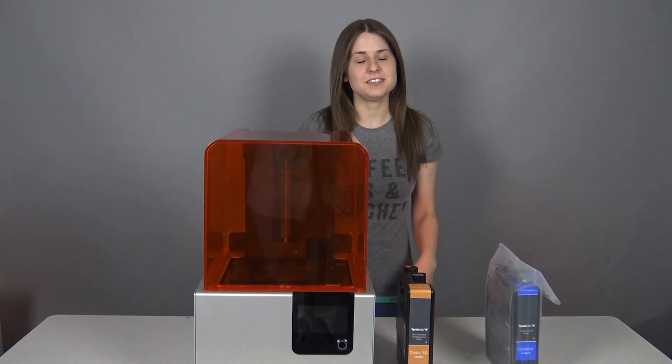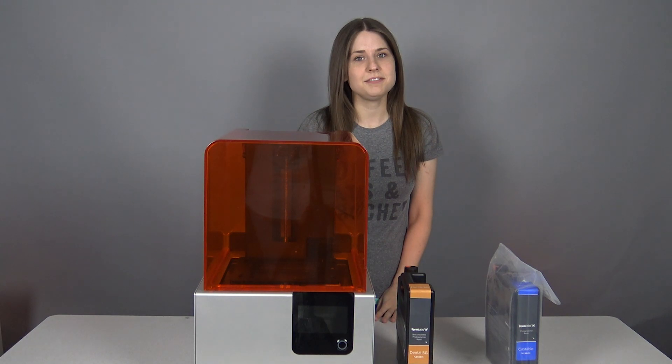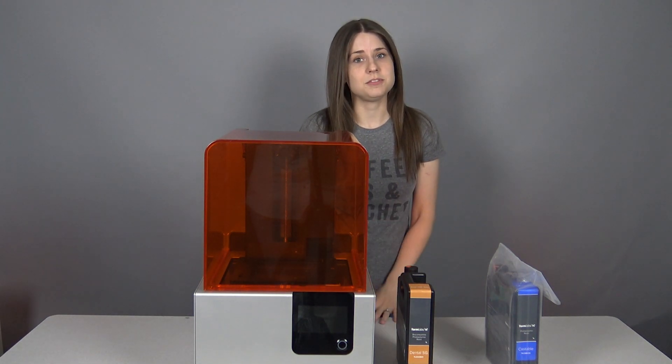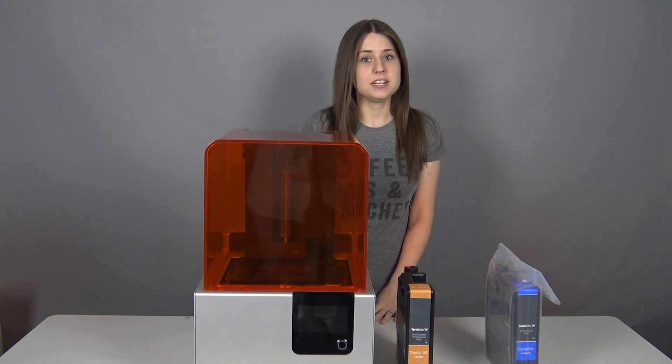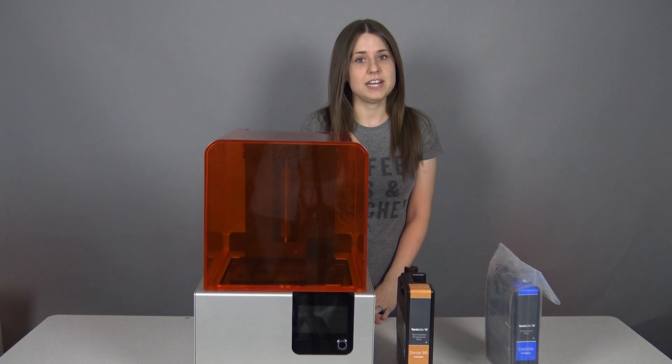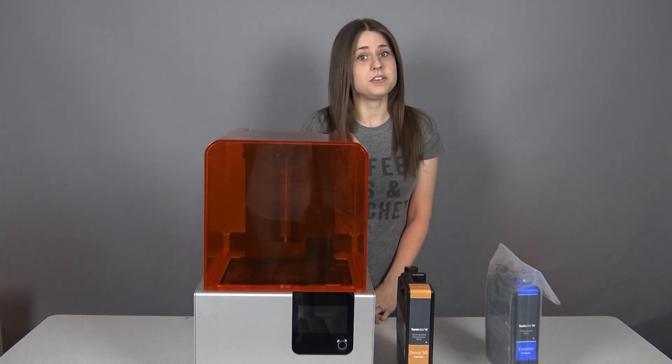Hello, this is Robin from CAMP, and this is another episode of Dental Lab Life. Today we're going to talk about the different resins that you can put into your Formlabs 3D printer. We're going to show you some pictures for each indication type for each material, and we'll even add some links to show you where you can purchase them.